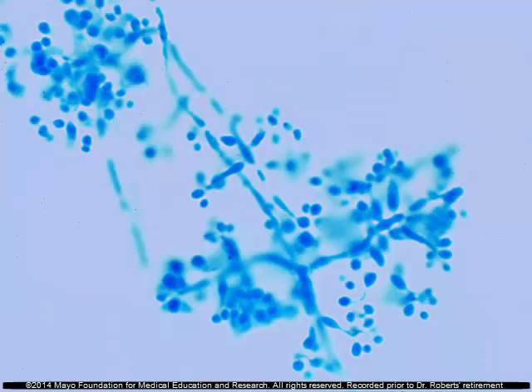And here you can see it again. This has many more spores. If you look at about maybe 4:30, you can see that the spores are produced kind of on one side and then the other. And if you look closely, you'll see they're attached by a little tiny structure. Not the easiest thing to recognize because it is so small, and you do have to use oil immersion to be able to recognize the structures.